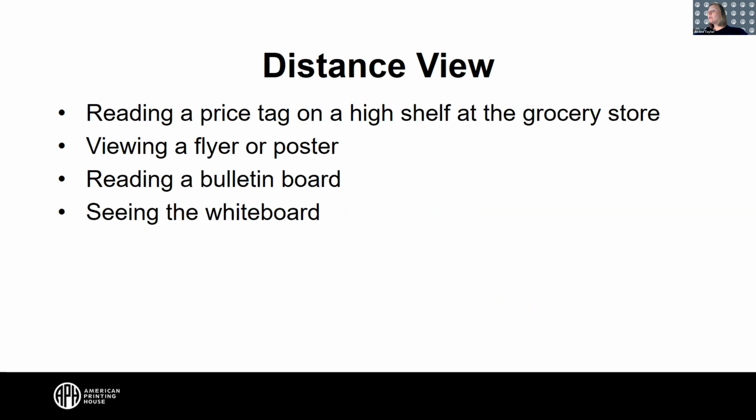Yeah, absolutely. So the distance view, you can see at a distance of 15 feet. So you could really use the camera when you rotate it to that distance position. You could use it to read a price tag. You could use it for viewing a flyer or a poster, a bulletin board, or the whiteboard in the classroom.